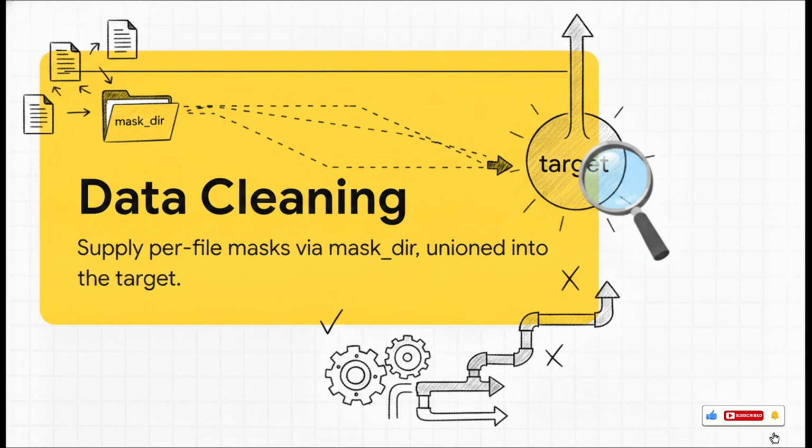And here is where the magic happens. These individual file masks are then automatically unioned directly into the target. So instead of dealing with some messy, totally manual cleaning process across huge data sets, the system just handles these individual masks and aggregates them perfectly for you. It is a game changer for keeping your pipeline transparent and highly efficient.